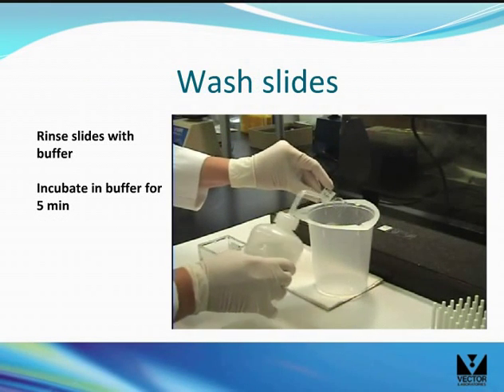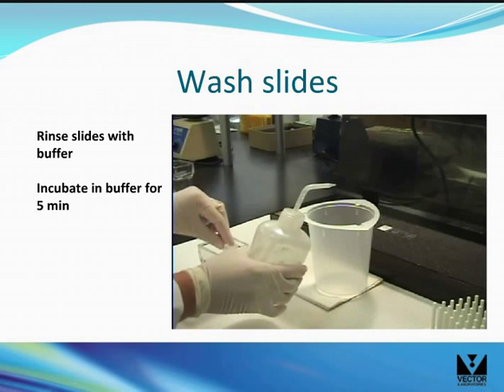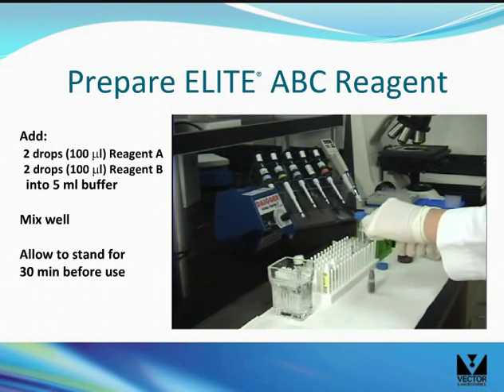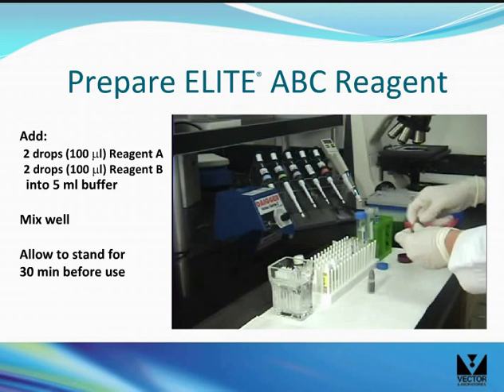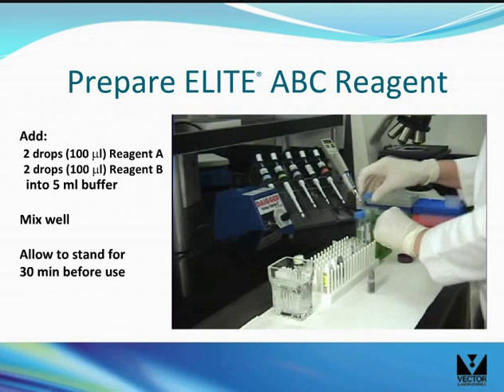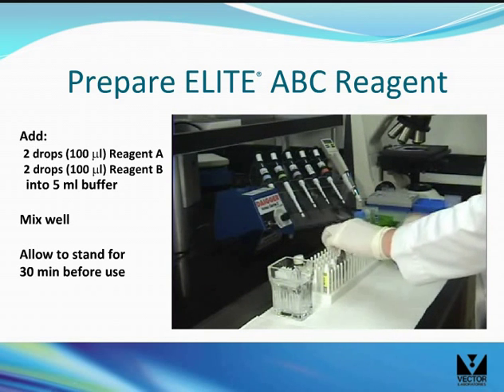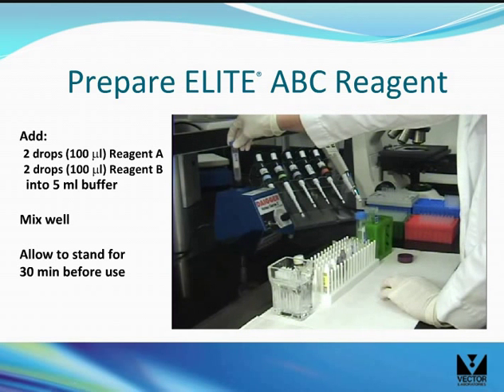Rinse the sections and place the slides in a Coplin jar for 5 minutes. Add two drops of reagent A into 5 mLs of buffer and mix, then add two drops of reagent B into the same solution and mix. Let the solution stand for about 30 minutes before use to allow the proper complex to form.